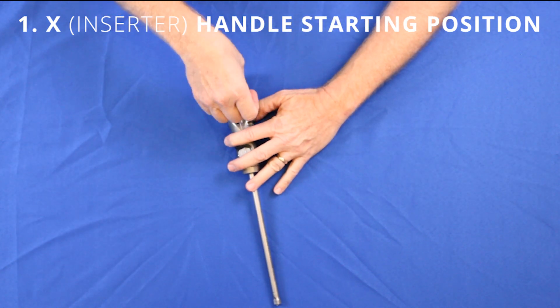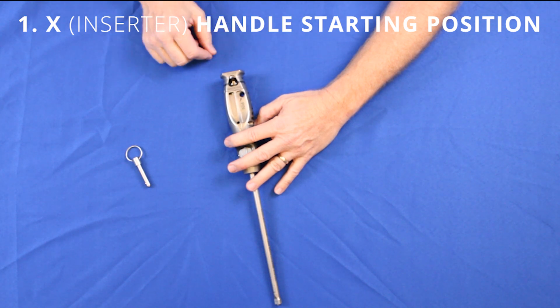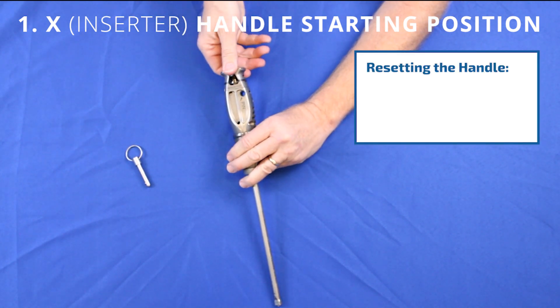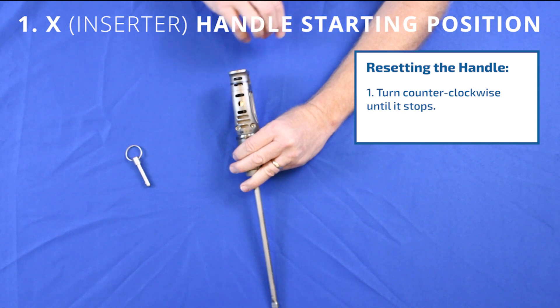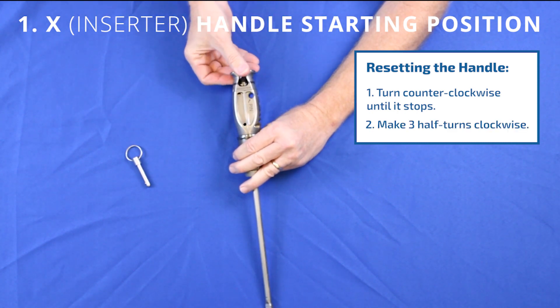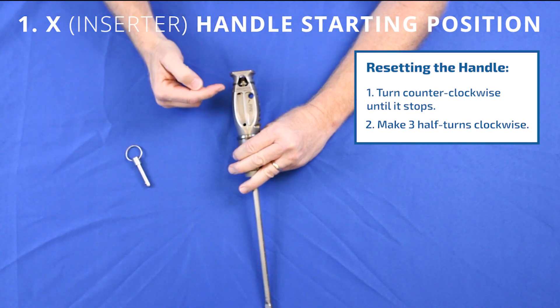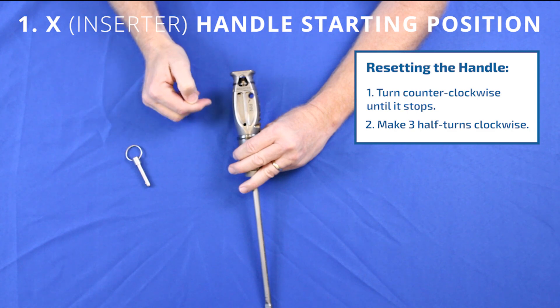If for some reason the pin has been removed — by SPD for example — or you're setting up for a second level after a first level Dual X, do this: turn the handle counterclockwise until it stops and then three half turns clockwise. That will put you in a position where the ring is lined up with the laser mark and you're ready to load the implant again.